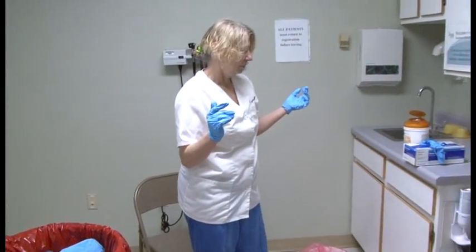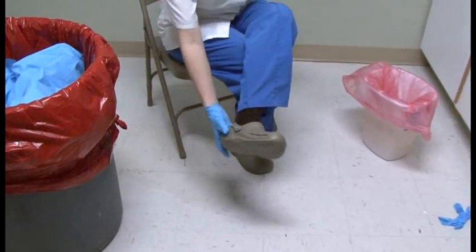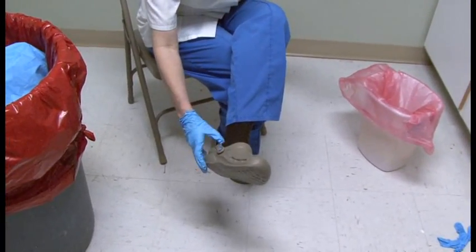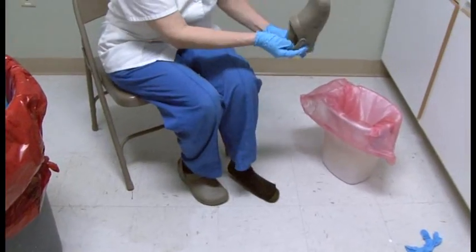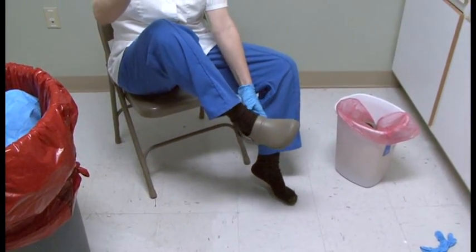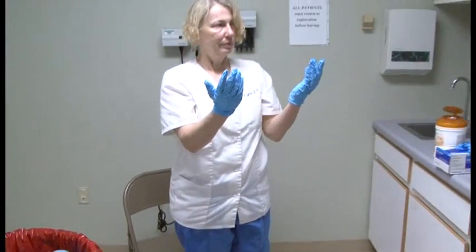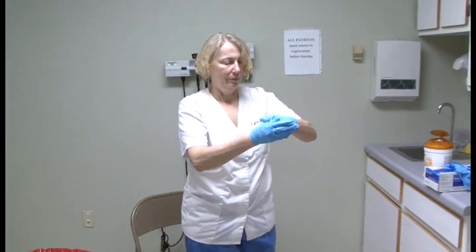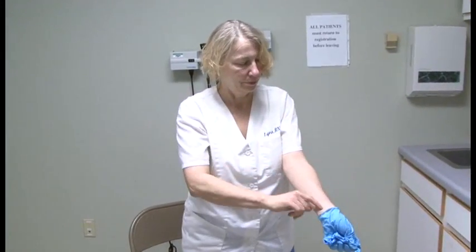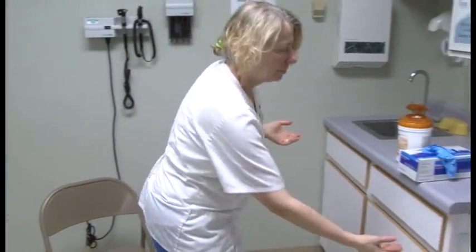Lynn removes her Crocs and puts them into the container with the bleach wipes. She then removes her inner gloves using the glove-in technique and performs hand hygiene.